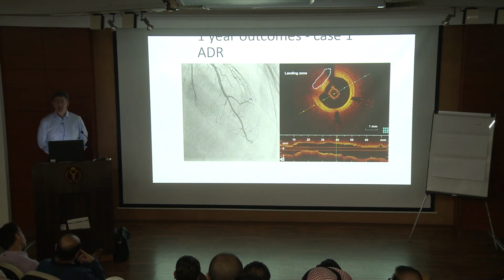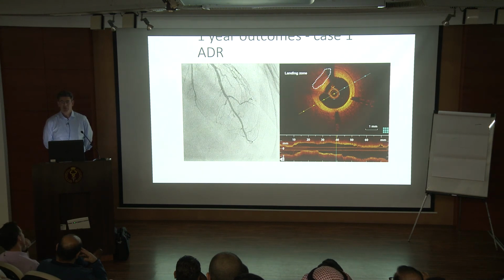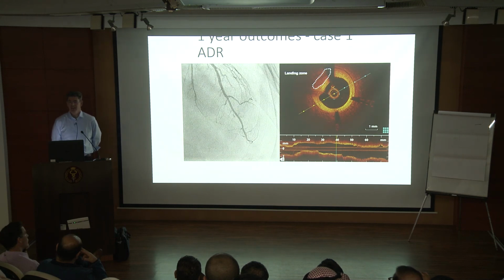And the signal that we're getting from this data set is really astonishing in that vessels heal up in a remarkable way, whether you're in the subintimal space or in the true lumen, and with very good evidence from OCT that there is no adverse healing consequence of having a stent in the subintimal space. So the message really is that once you've got flow, then the flow begets re-endothelialization.